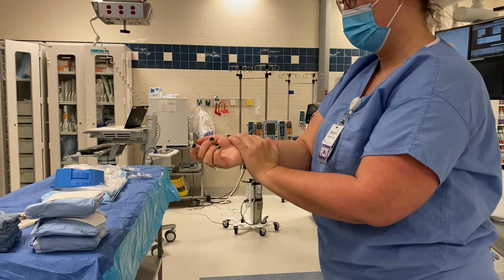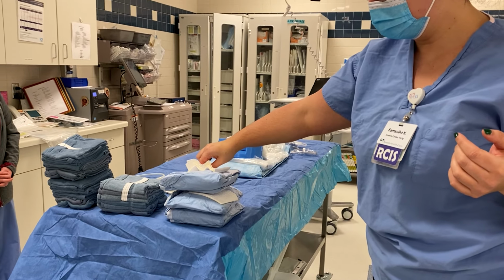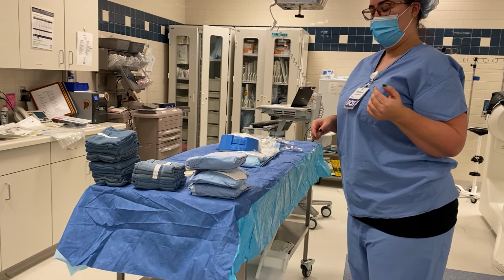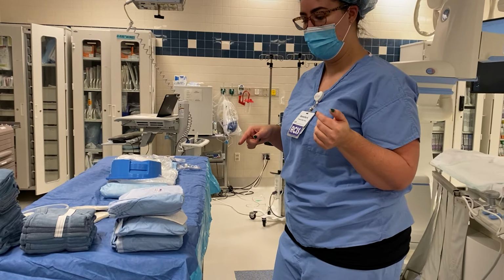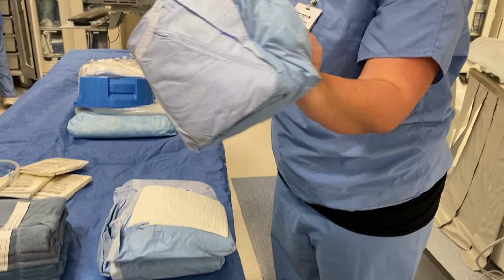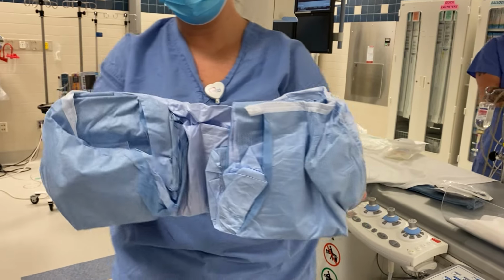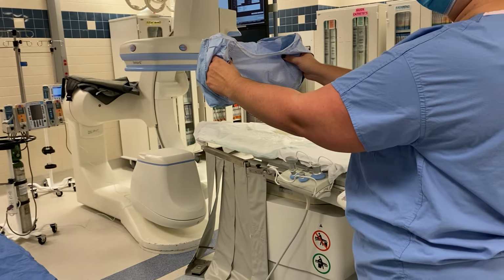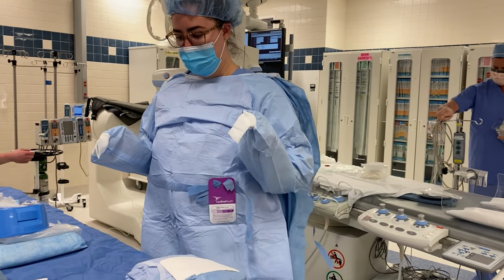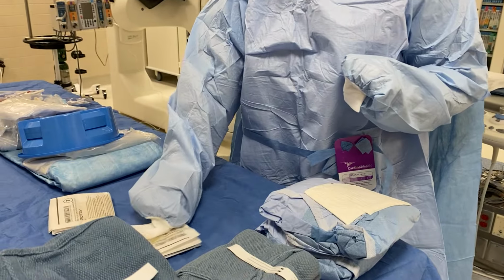And now I'm going to want to wear my sterile gown while I'm setting up this table. So the first thing I'm going to do is I'm just going to remove this piece right here. Again, I'm not touching the gown itself, so I'm not contaminating anything. And now to put the gown on, what I want to do is I want to find where the armhole is. So on this gown, we can see the armhole is right here. So I'm going to reach right inside there and grab it. And then you'll see I have another armhole right here. So I can put my fingers in there. And then all I'm going to do is let it go and extend my arms. And my arms will go right into the sleeves. So then, keeping my hands inside the gown, I'm going to find my gloves.